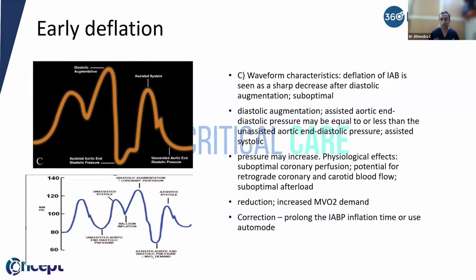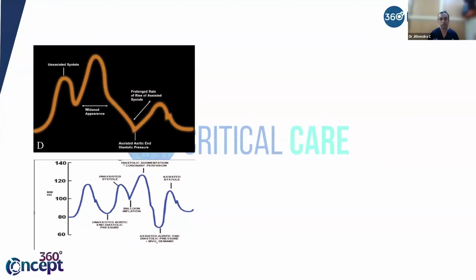So what do I do? Again, I time it, and bring it down to that position. If you can't time it, or you are too lazy to do that, you can just put it on auto mode. It will optimize it. Okay. Last one with the timing. So what is left behind? So this is the thing. What is happening here? Anybody?